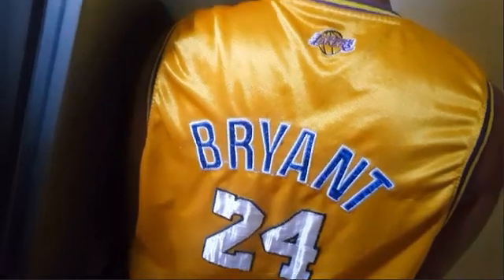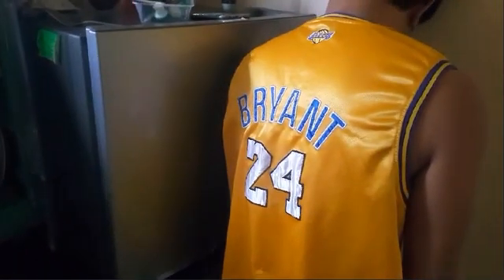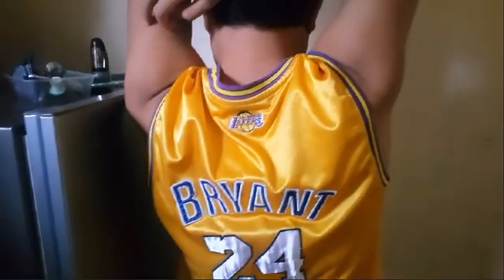And you can also recheck the body position kasi if nakalin ang patient against the grid, can cause foreshortening. And if bag-bend forward naman, baka ma-distort ang mga structural outlines of the thorax. So the lower part of the thorax and the hips are at a greater distance from the IR because this is necessary for a true lateral projection.